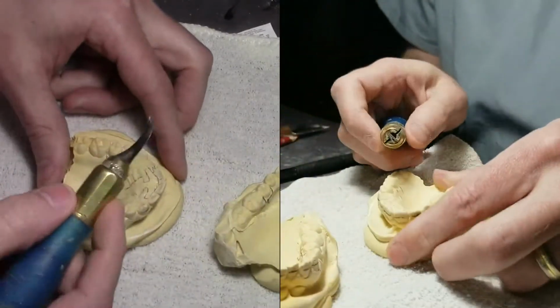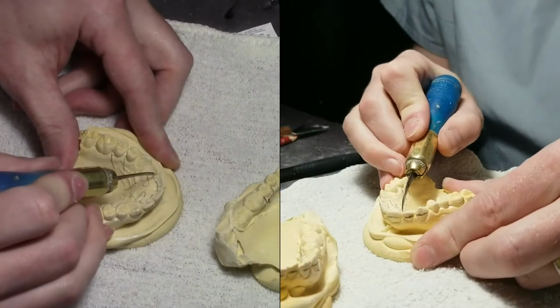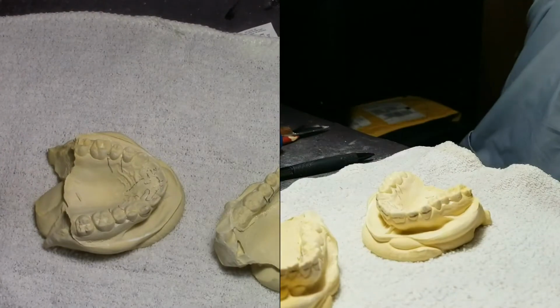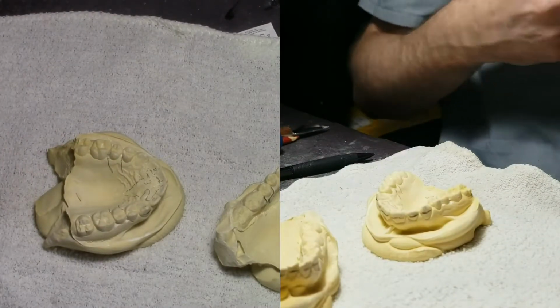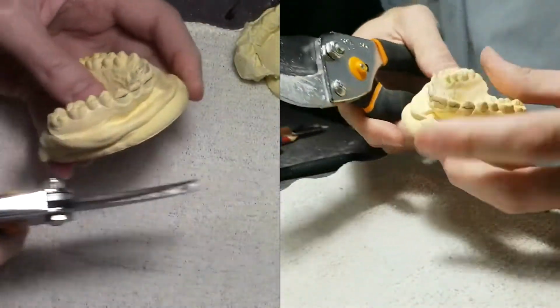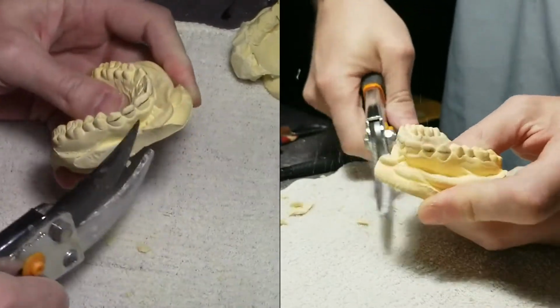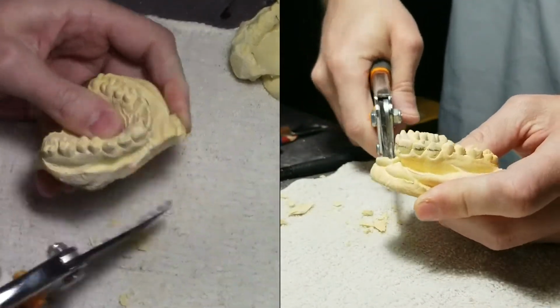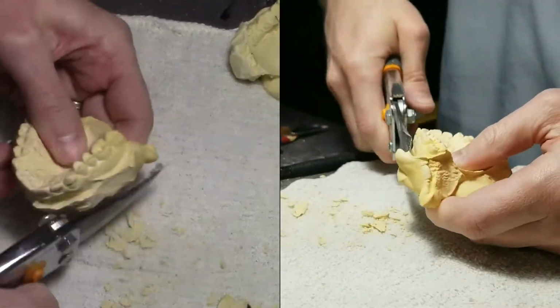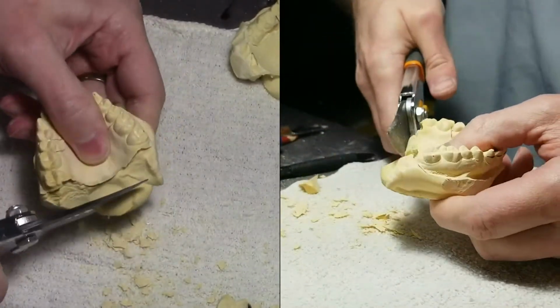The first thing I do is I score between the teeth. And you know what I wanted to do is show you guys me trimming these. It's going to make a mess, but I got my handy dandy pruning shears here. And sometimes I'd like to just trim this. Sorry for the sound. I usually do this over a trash can. As you can see, it makes a pretty good mess.